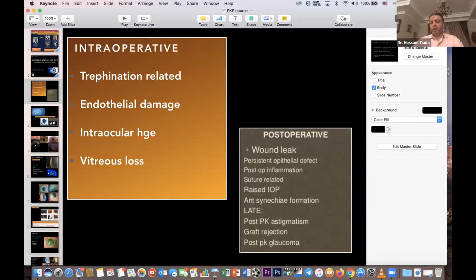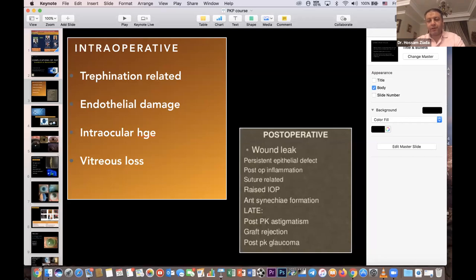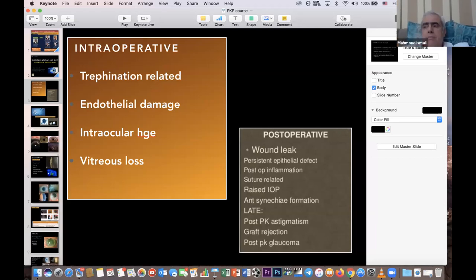Yeah, okay. As you see, I'm insisting on asking this question many times in different ways, because I have seen a lot of surgeons who are washing the posterior surface of the cornea directly with the syringe. Flushing, which is traumatizing to the endothelium. So I prefer to drip drops on the forceps, and these drops will go down slowly and gently on the back of the cornea. Thank you very much.